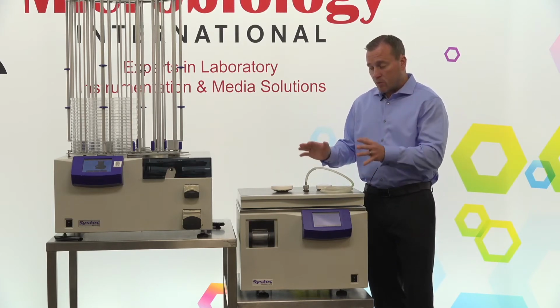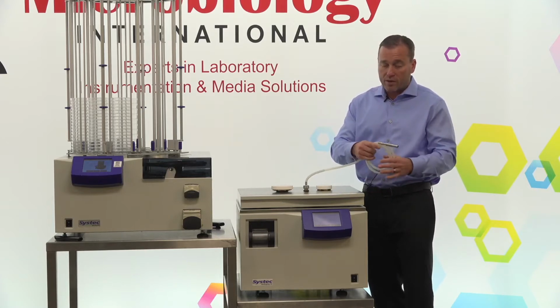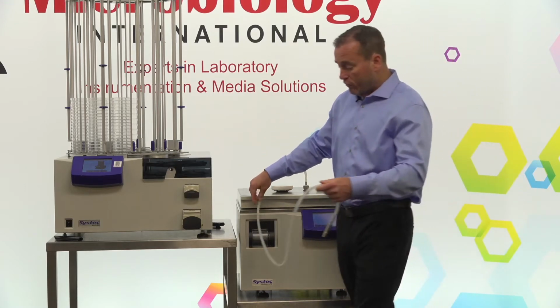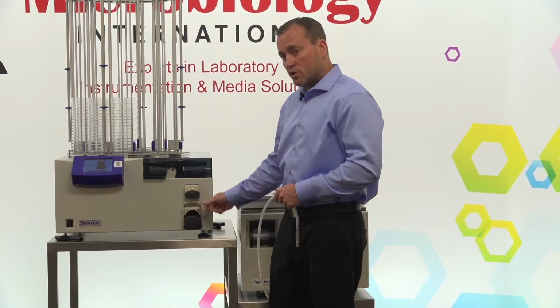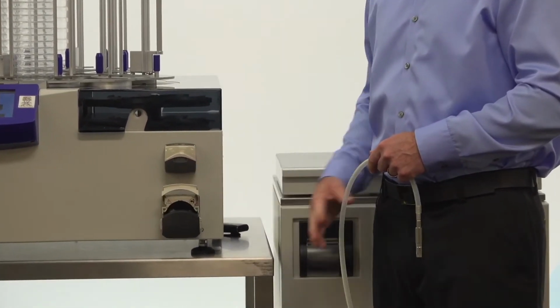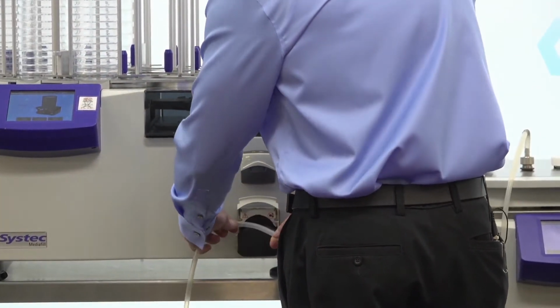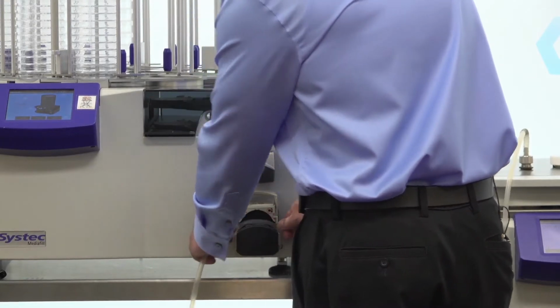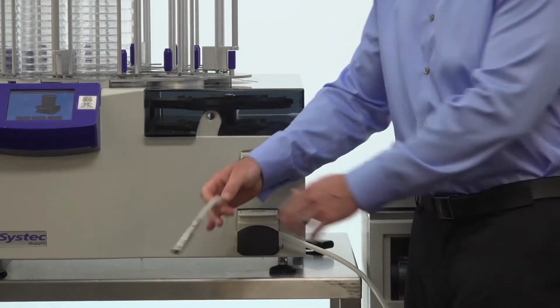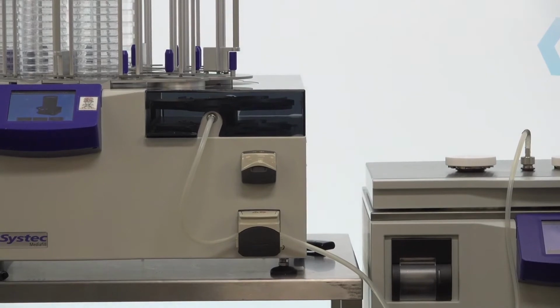Once that's finished, we would then connect over to the MediaFill. Connection to the MediaFill is only through tubing, so the two units do not communicate really. It would just simply go over to the easy load pump. The pump just has a really easy way to load into that. Just opens up, the tubing gets inserted, and we just close it down. So now we've loaded our tubing into the system, and then the port for where we would remove and pump media into the unit is located here.